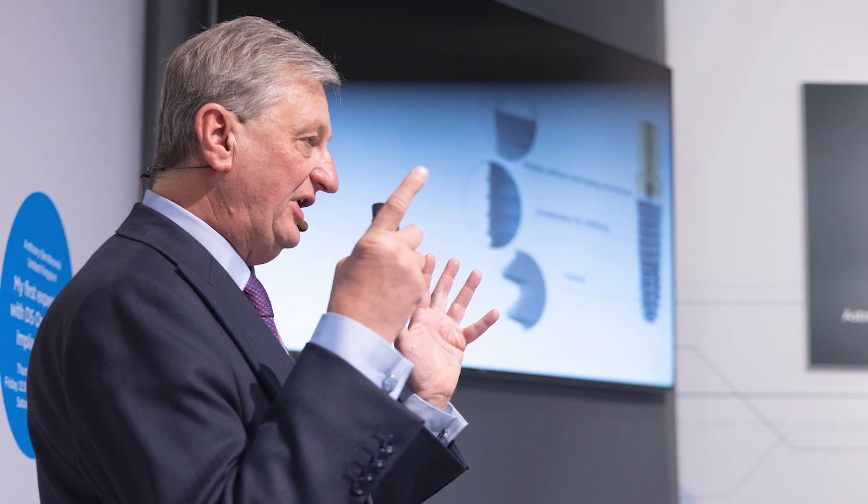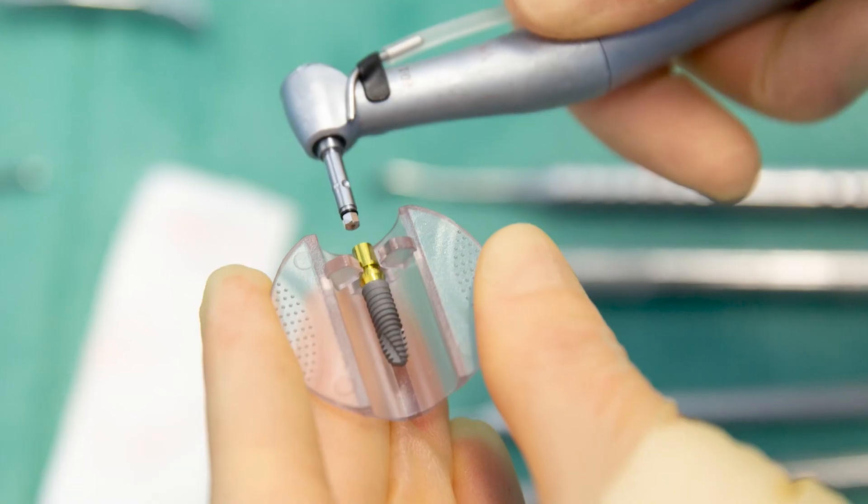It's great having an intuitive surgical protocol because it means your surgery becomes effortless, and you can use all of your skill and capacity to look after the patient, even in difficult clinical situations. The implant is there to help you, not to hinder you.